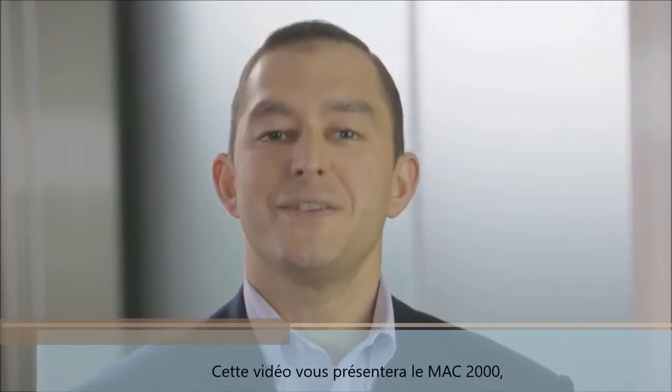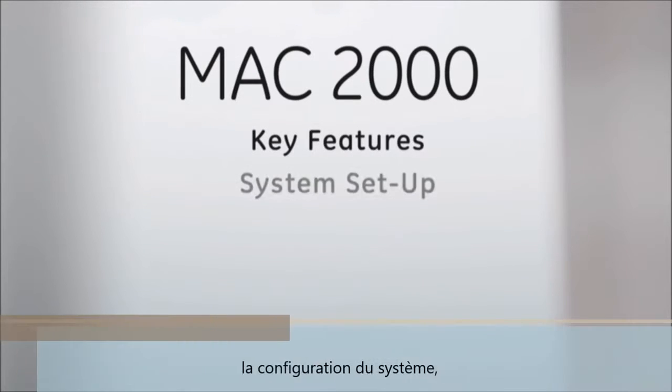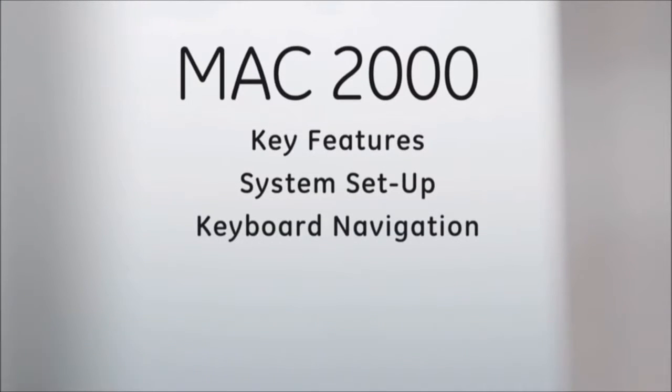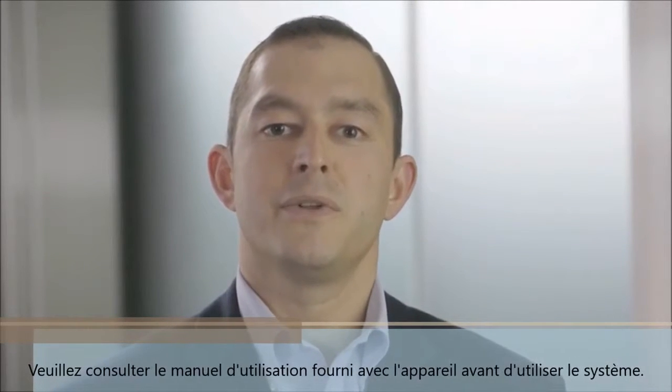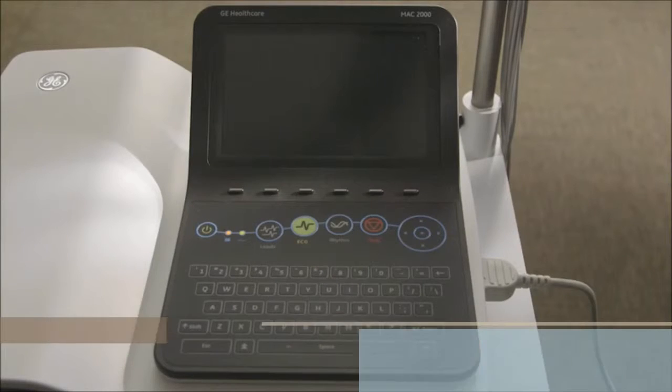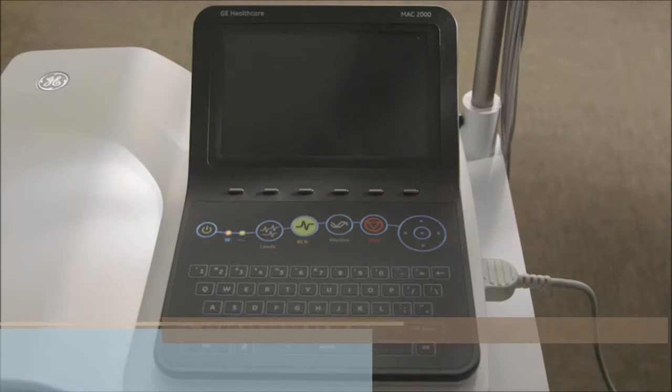This video will provide you with an introduction to the MAC 2000, covering key features, system setup, keyboard navigation, lead placement, and acquiring an ECG. Please take a moment to review the operator's manual that came with your system prior to utilizing the unit. Let's take a quick look at the unit and the external connections.